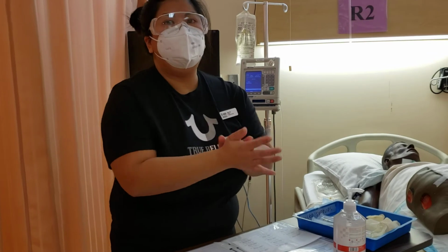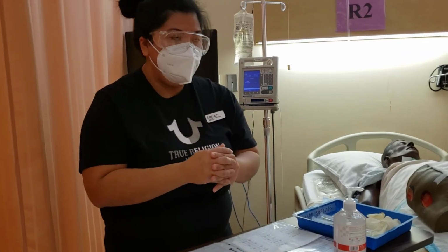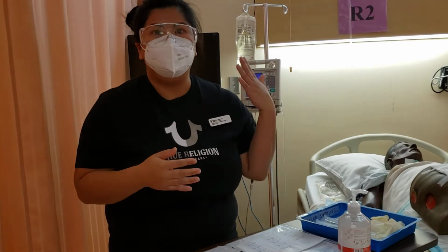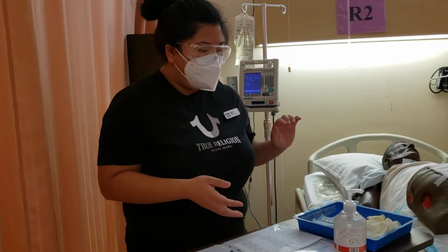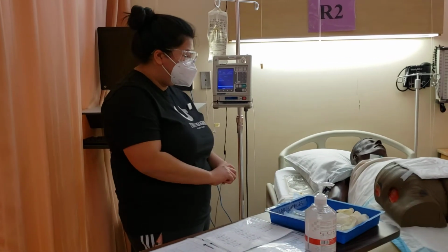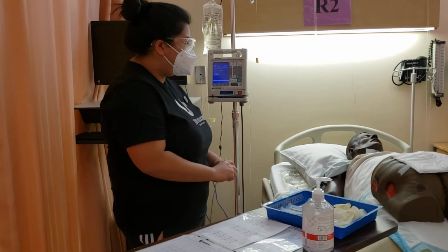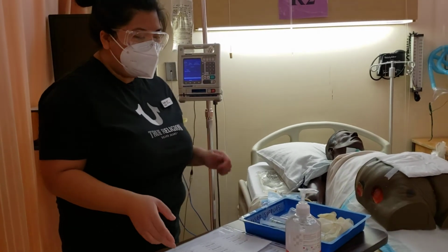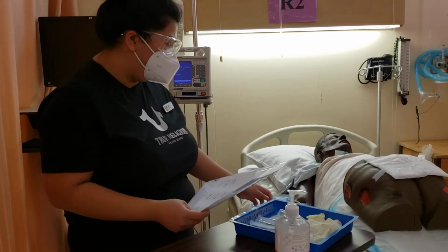So I'll do hand hygiene and enter my patient's room, introduce myself to the patient, make sure I have the right patient, and explain the procedure. Hi, my name is Alex Cruz. I'm a year 3 student nurse at the University of Manitoba. I'm here to obtain a blood sample from your central line. Is that okay with you? Our patient agrees.